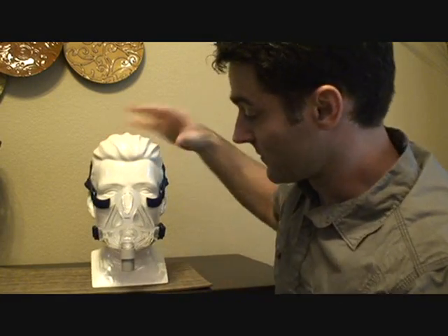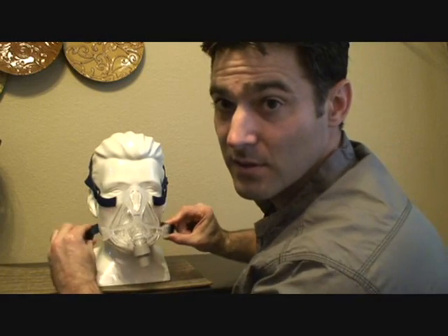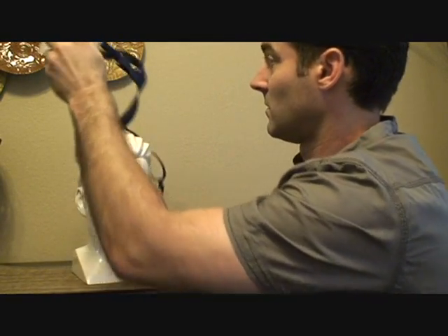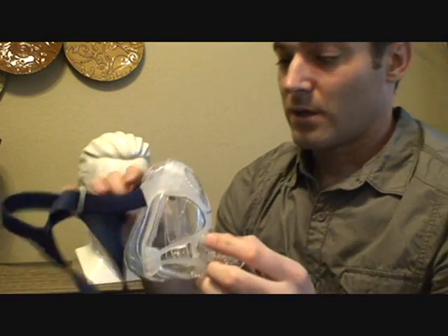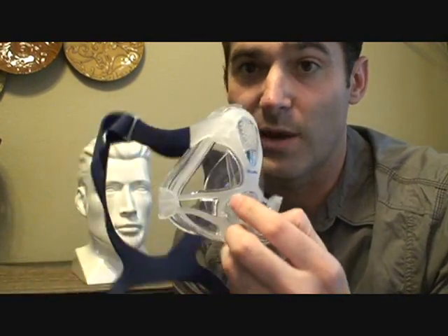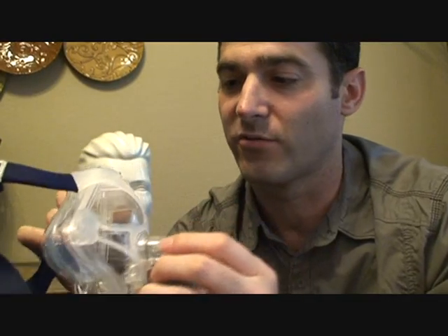Getting out of this is very easy — either one clip or both clips, undo them and pull the mask off. If you want to clean this mask, one of the nicest things about it is that unlike masks with fabric headgear, this has an actual headgear skeleton or frame.